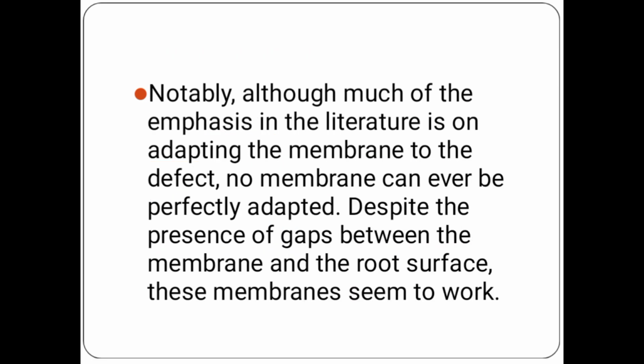Notably, although much of the emphasis in the literature is on adapting the membrane to the defect, it is very important that the membrane adapts to the defect, meaning it should be properly placed. But one thing is also important: these membranes are artificial, so it takes time to adapt perfectly. At the end of the day it is artificial, and an artificial thing needs time for proper adaptation. Sometimes it does not adapt. Despite the presence of a gap between the membrane and root surface, these membranes seem to work. You will wonder how they work, but they actually do.